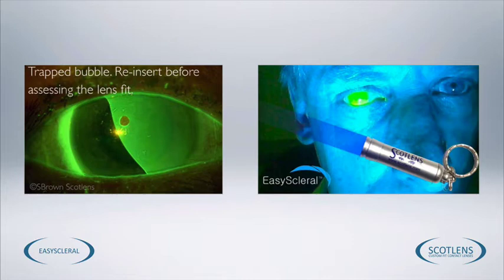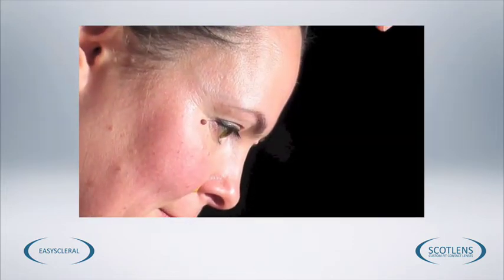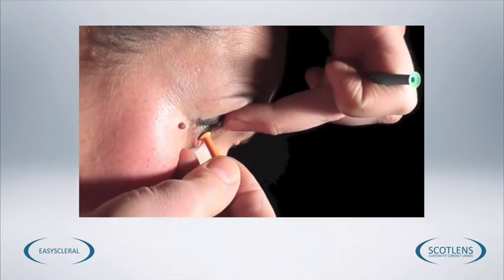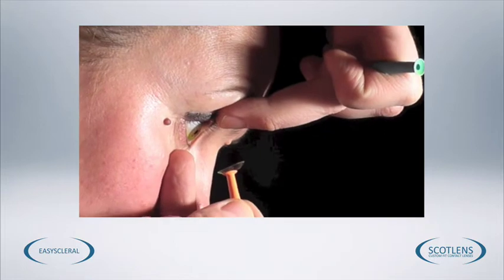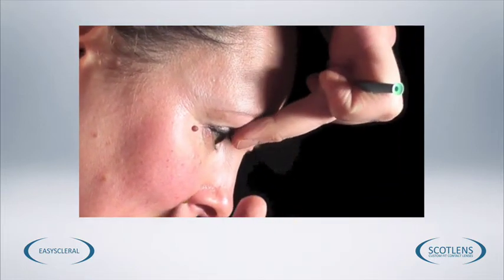If we need to remove the lenses, they are easiest to remove with a solid contact lens sucker. Hold the lids out of the way just as you did for insertion. Place the sucker on the lens at about the 6 o'clock position, and the lens should just easily remove from the eye.